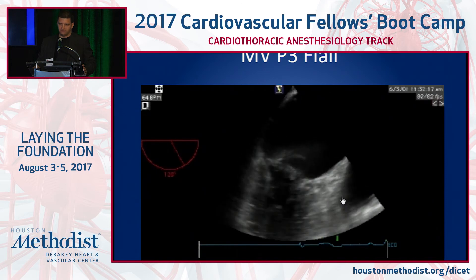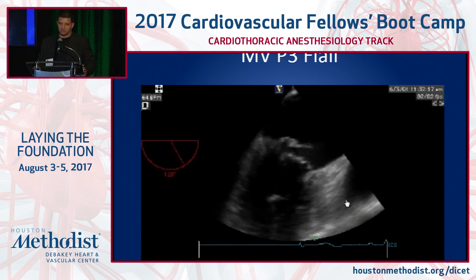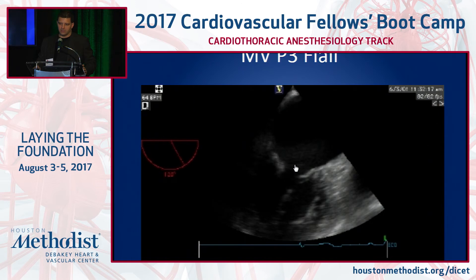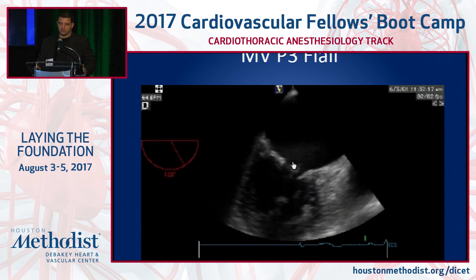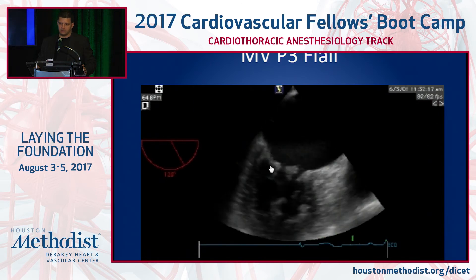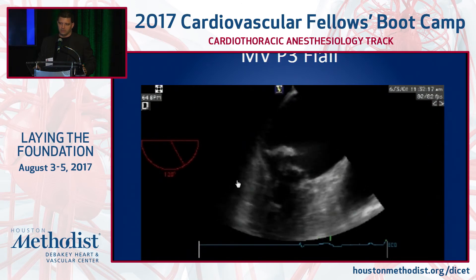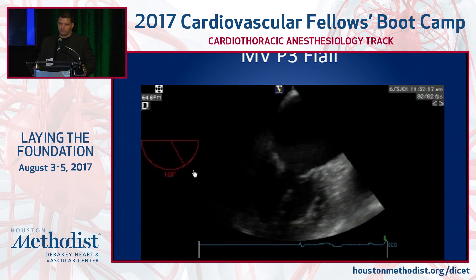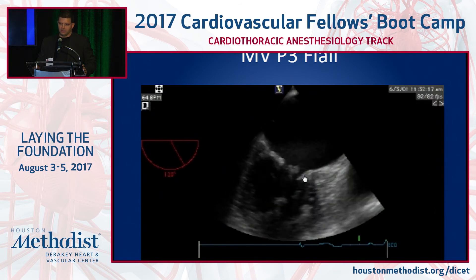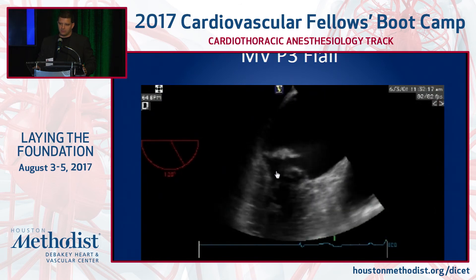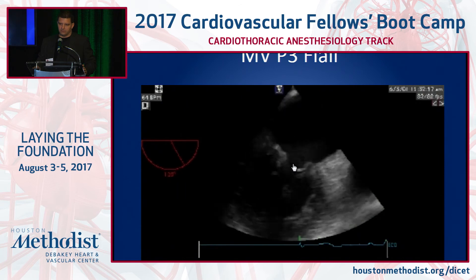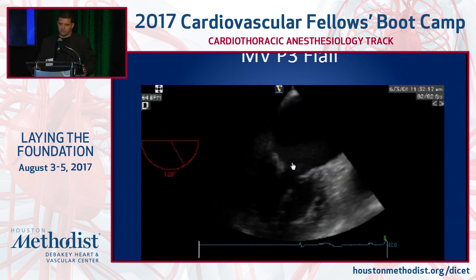A P3 flail this time. Remember the difference between flail and prolapse? You have a piece of the edge of the mitral leaflet, including a chorda tendinea, going above the annular plane. You're looking at a long axis view of the mitral valve here at around 120–130 degrees. You can see the anterior mitral valve leaflet here, the posterior mitral valve leaflet here. This is a P3 prolapse right there.